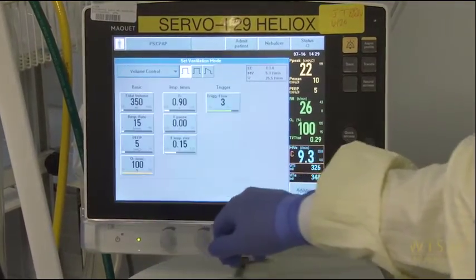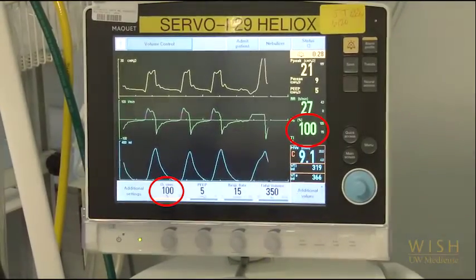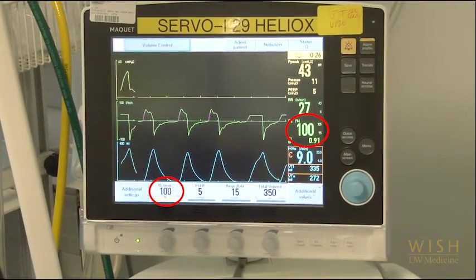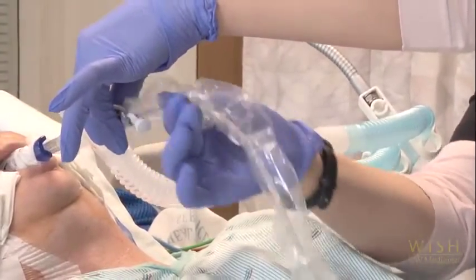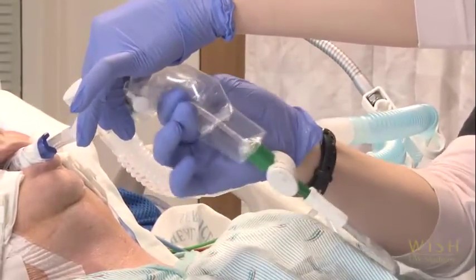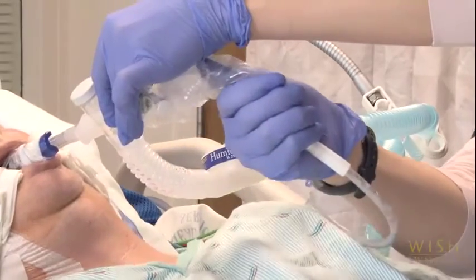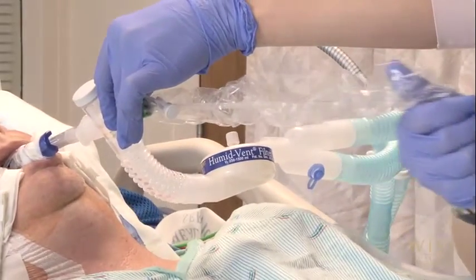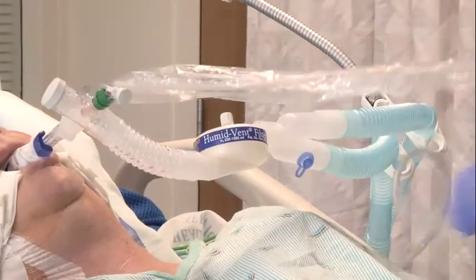Prior to actually performing bronchoscopy, one should pre-oxygenate the patient with 100% oxygen and order and administer pre-procedural sedation and analgesia. It is frequently useful in intubated patients to first perform inline endotracheal suctioning to clear any accumulated secretions in the upper airway and the endotracheal tube. This maneuver is also a useful test to determine if the patient should be preemptively given more sedation.